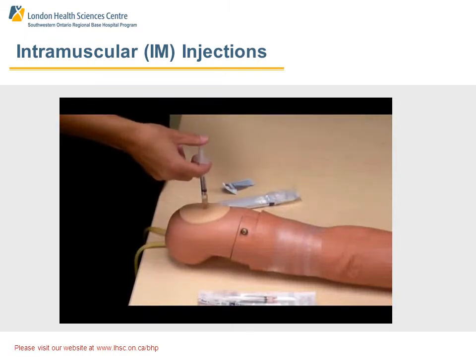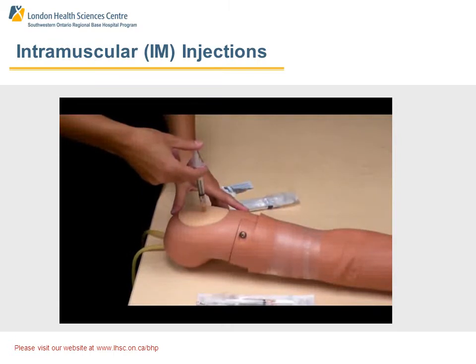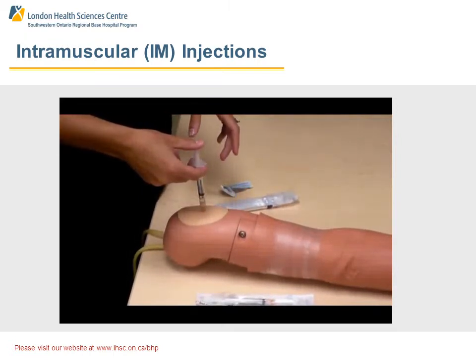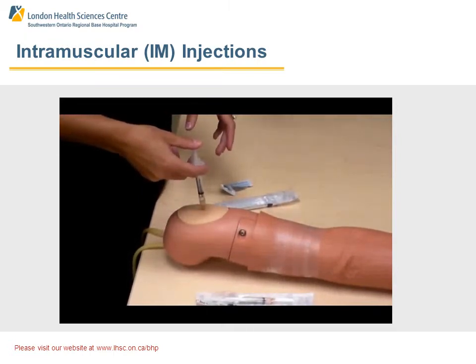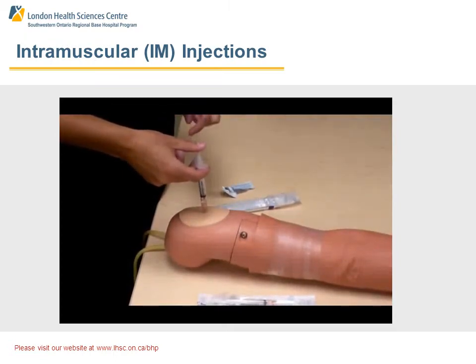Push this, no, that's wrong. I would pull it out, because that means you're in a vessel, which means it could be an IV or intra-arterial injection, which may be wrong if you're dealing with certain medications sclerosing to the vein, or also causing spasm of the artery. And that would be a medication interaction and a negative event. So we wouldn't want to inject in that situation. Perfect. So in that case, I would withdraw the needle and start all over again.